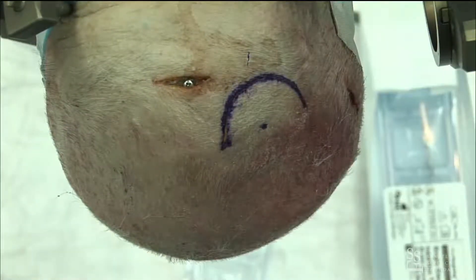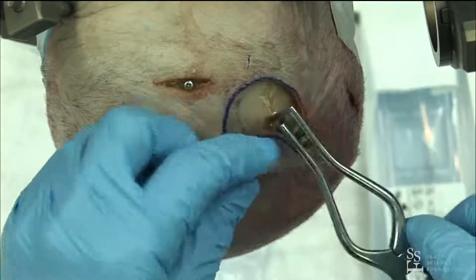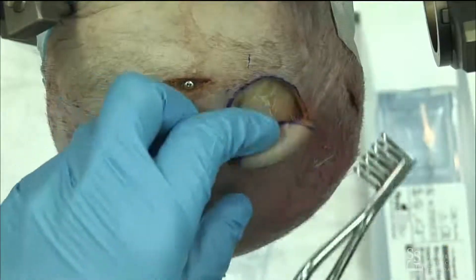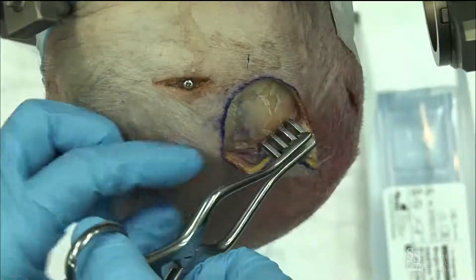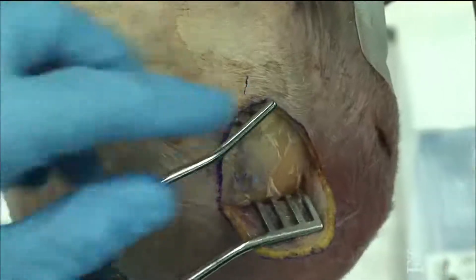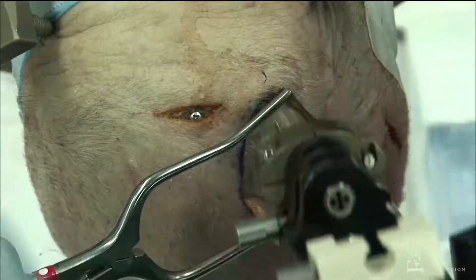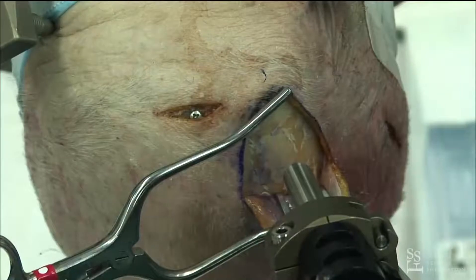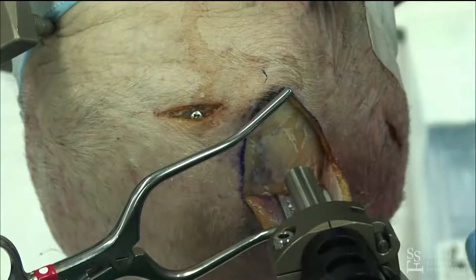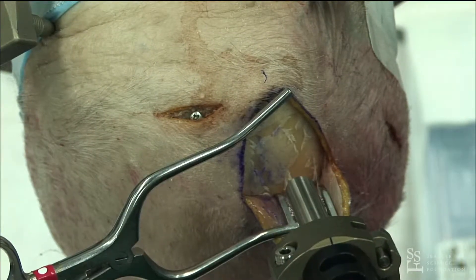Get a little Weitlaner retractor. Lock that in. Now we're going to go back and re-mark our entry point before we drill. Once I use the perforator, I'm going to switch to a burr.